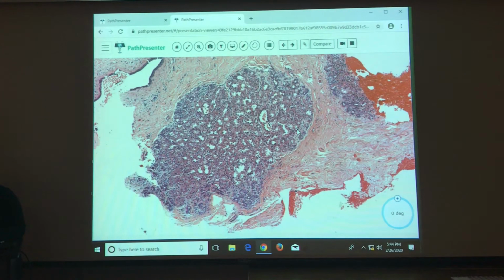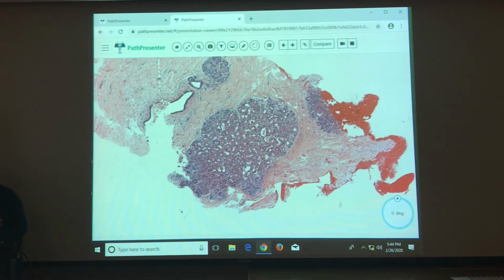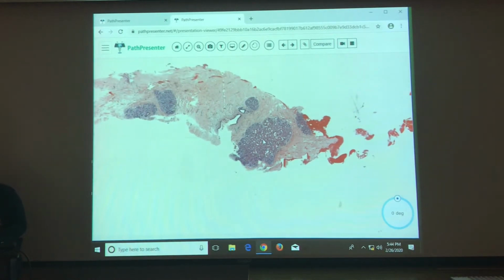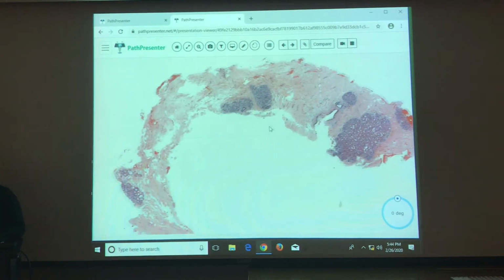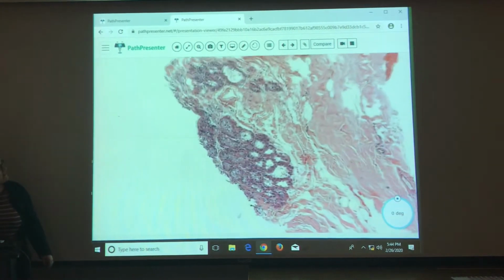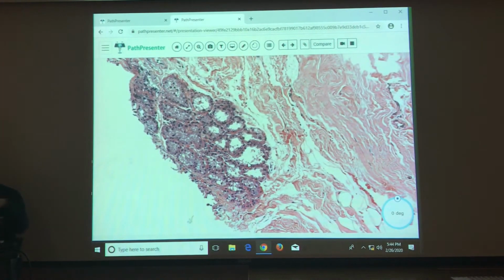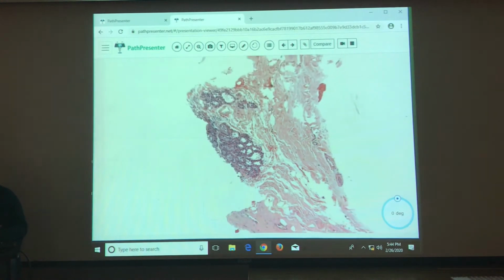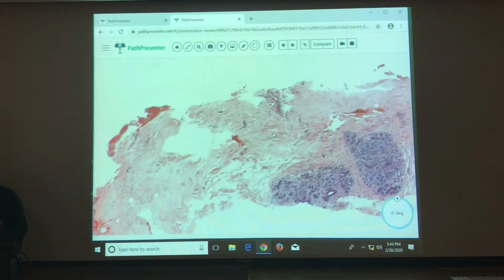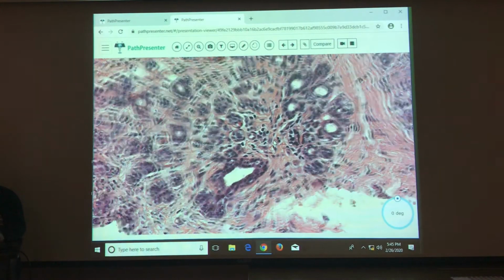So that's what this looks like. The few times I've actually seen this where it wasn't the entire lesion looking like this, I was like, is this invasive carcinoma? Because it kind of gives you that picture, right? I think there's a little more over here, but that's kind of what they look like. It's just still not great secretions in there, but they're so plump that they're coming off the wall. That's kind of what you're looking for. And then those are just regular lobules.